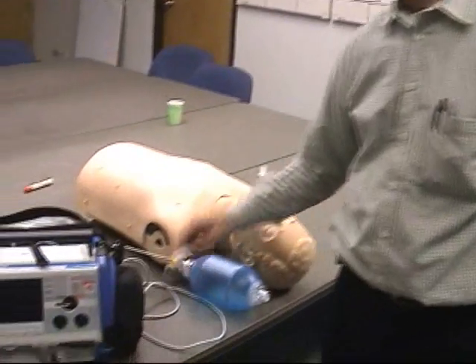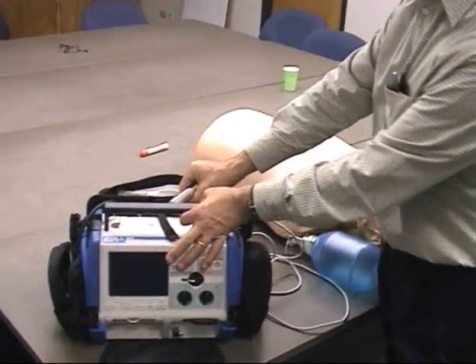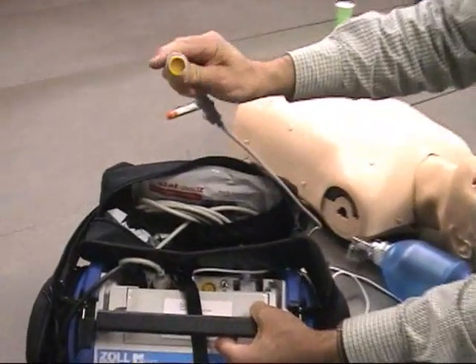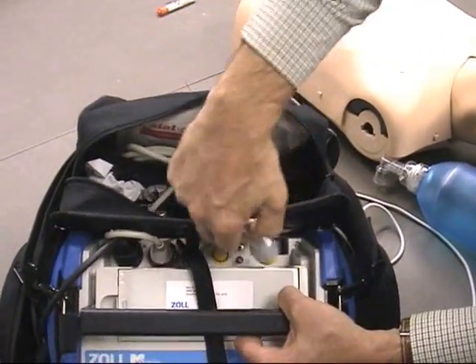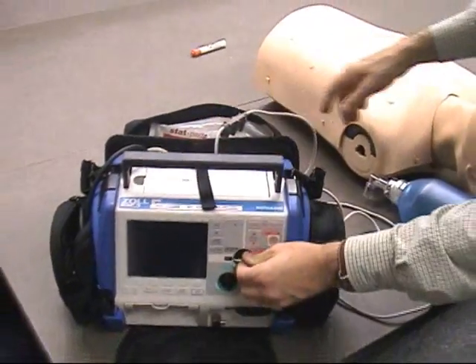We're going to start out with the end-tidal CO2 sensor not attached to the M-Series. We're going to find the connector on the back of the M-Series, connect the sensor like this, and turn on the monitor.